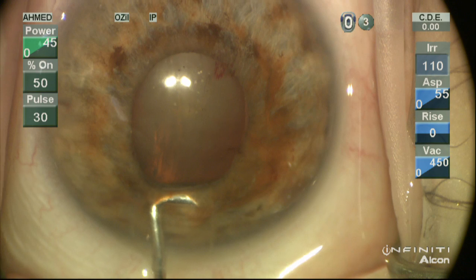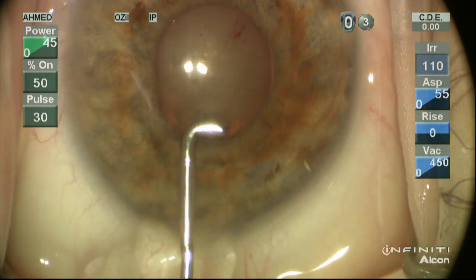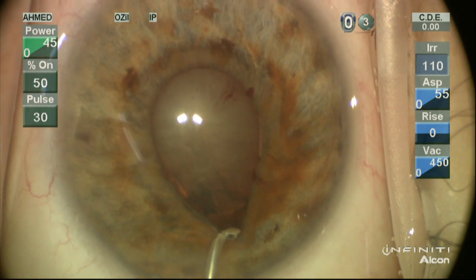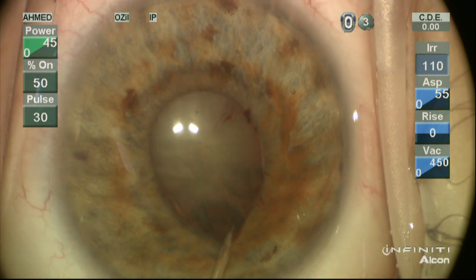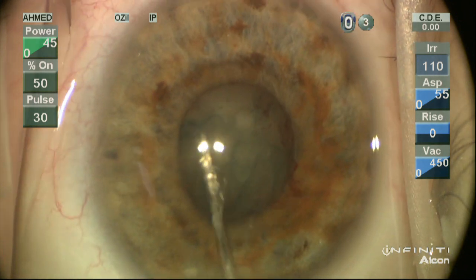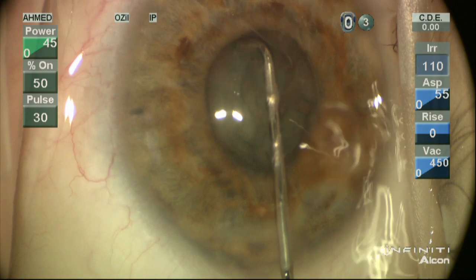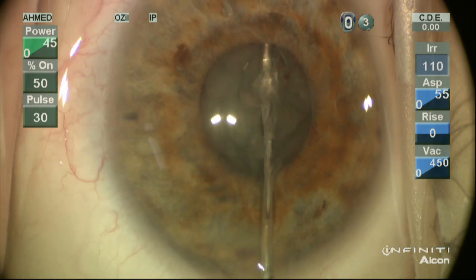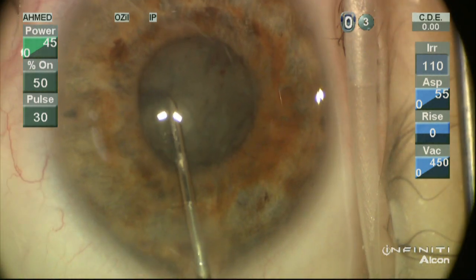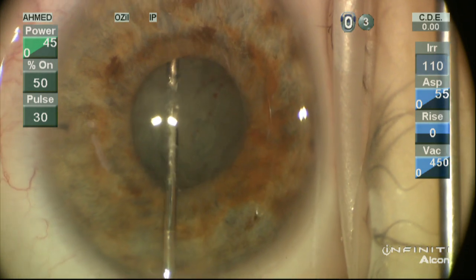We'll release some of the viscoelastic prior to the hydrodissection steps. The concern is iris prolapse, so we want to decompress the eye before injecting BSS into the capsular bag. I like to use a fair amount of gentle hydrodissection and, if necessary, hydrodelineation — in this case it's more hydrodissection. We look for that posterior wave and move around 360 degrees around the capsular bag for adequate hydrodissection. I spend time on this, as it pays off for the phaco and cortical removal, doing it gently to avoid excessive pressurization and potential iris prolapse.